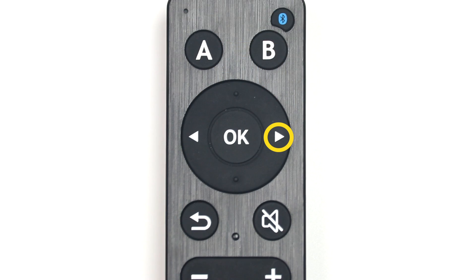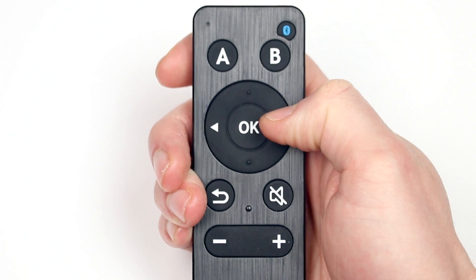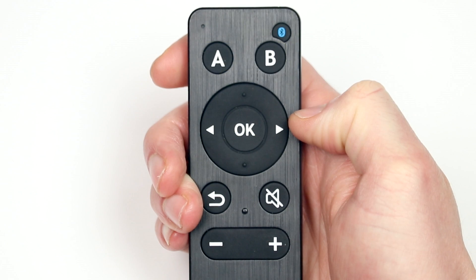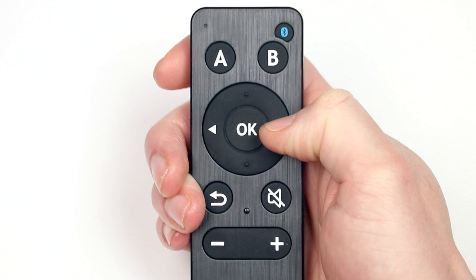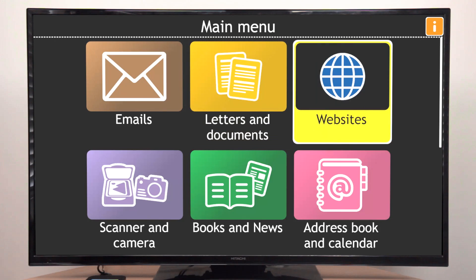Pressing the right edge of the pad moves you to the next item on the screen. For example, moving to Letters and Documents, then to Websites — selecting this option lets you visit websites.